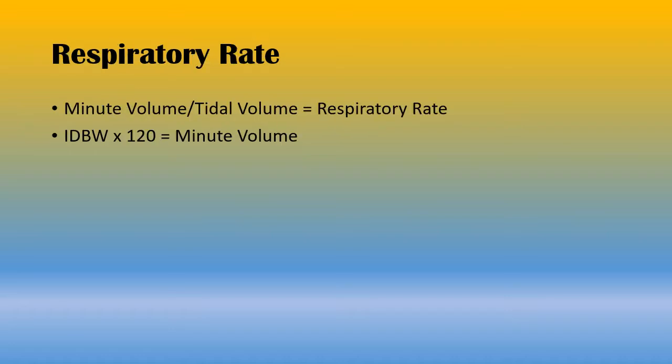Respiratory rate. If you think back to paramedic class, we taught you that respiratory rate is the most overlooked vital sign. So taking a vent patient is kind of cool in the fact that we can figure out whatever respiratory rate we want. But it has to be a normal physiological respiratory rate. We don't want to give it too high, we don't want to give it too low, although there are instances where you're going to raise your respiratory rate somewhat over normal.